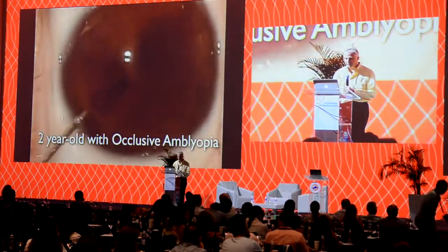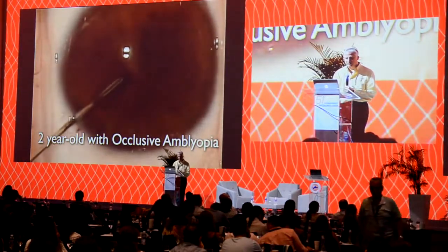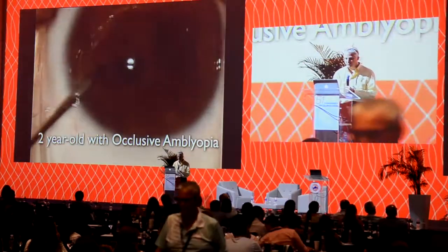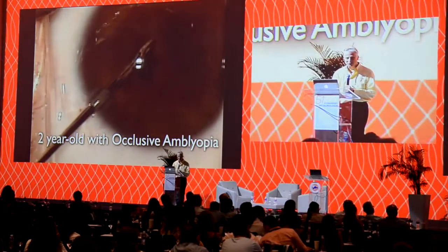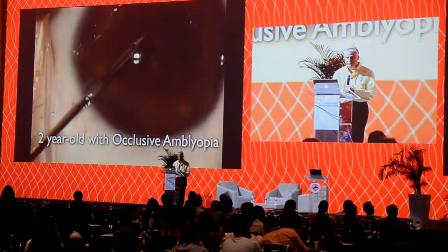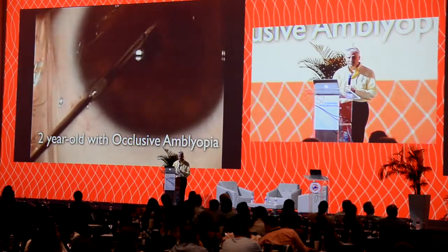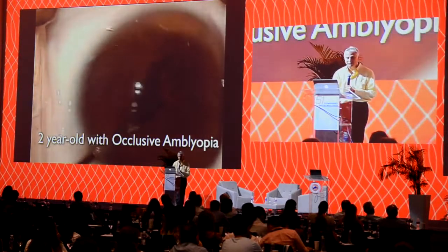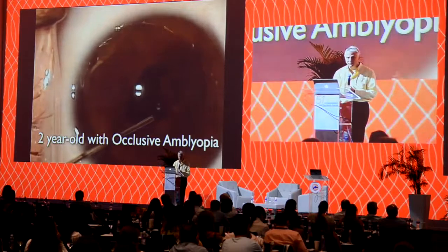So we took the patient to the operating room. We put a little bit of OVD in the anterior chamber. We put a little bit of OVD underneath the pupillary membrane. And we used this wonderful device, which I like to call a scissors. And we just gently trimmed the attachments of this pupillary membrane to the native iris. We're not removing normal stroma. We're not removing any sphincter muscle. The patient has been given mydriatic drops already. This is all just cutting the attachments of the pupillary membrane.